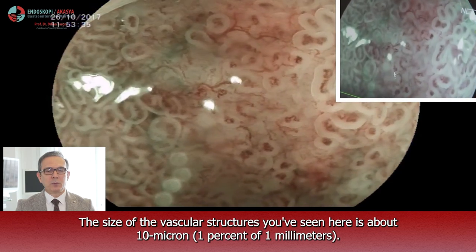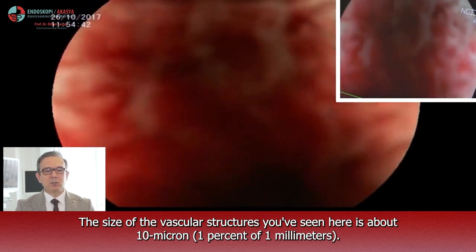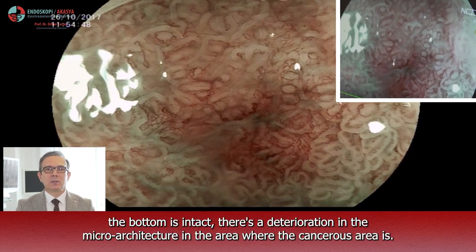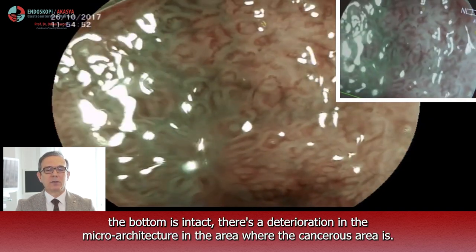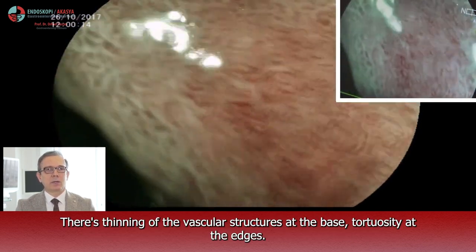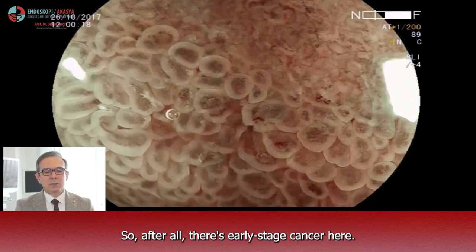The size of the vascular structures you have seen here is about 10 microns — one percent of one millimeter. There is a clear line of cancerous area below at one to two o'clock. The bottom is intact. There is a deterioration in the microarchitecture in the area where the cancerous area is. There is a thinning of the vascular structure at the base and tortuosity at the edges. So, after all, there is early stage cancer here.